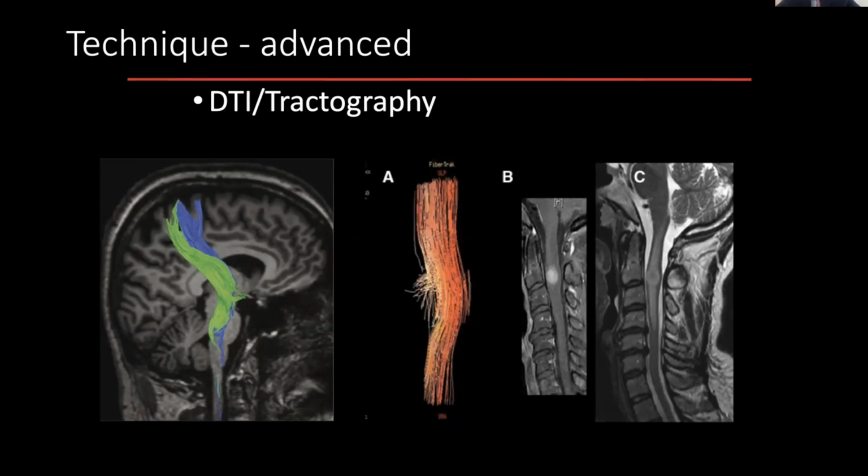Can you guys think of any areas where seeing restricted diffusion may be helpful in the brain, for example? Definitely seen it used looking for restriction in abscesses, strokes. Yeah, very good. So differentiating abscesses, which have hypercellular pus, as compared to tumors which are not hypercellular. That's one area where restriction is good. Also for stroke, for edema. Exactly.